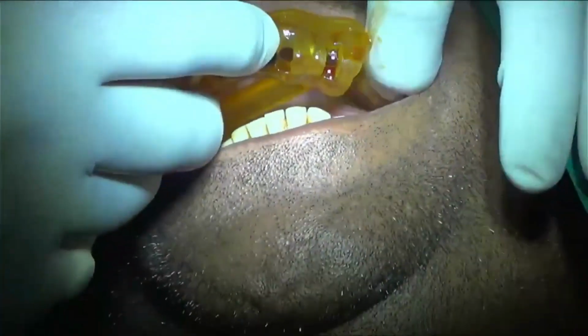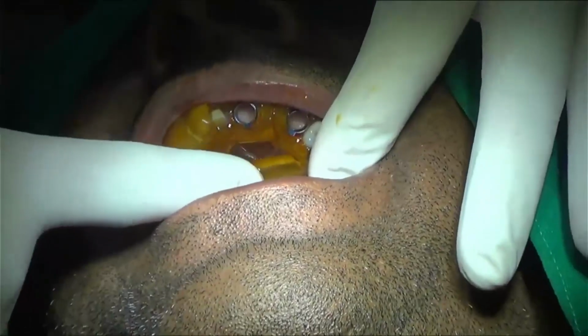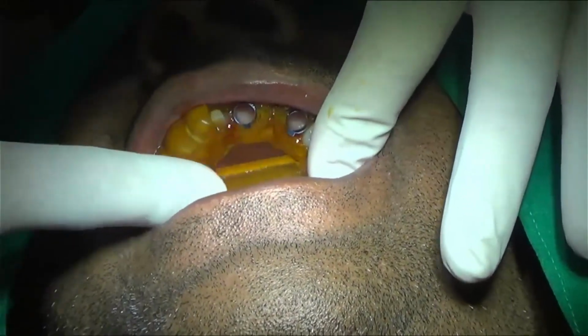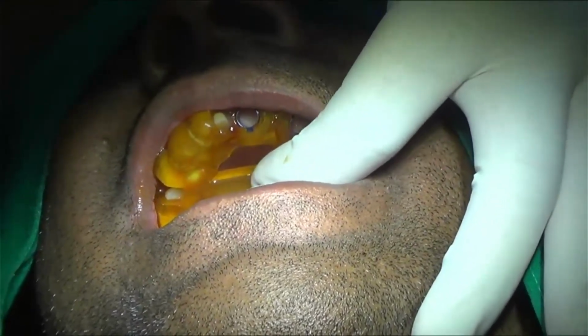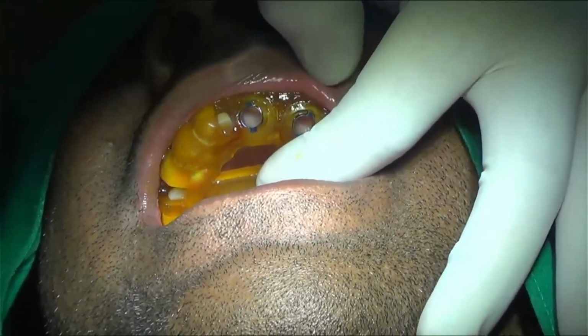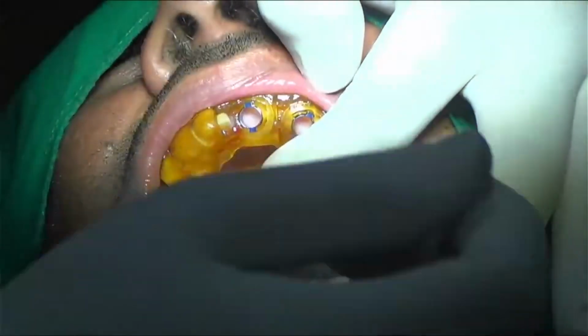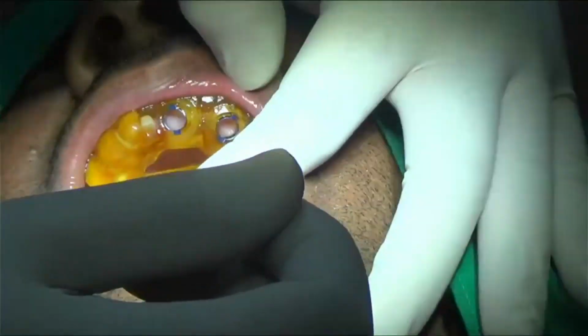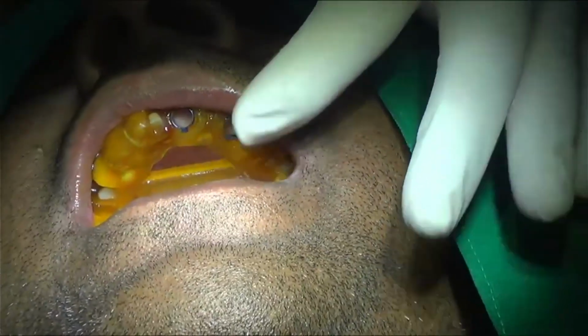The first and foremost thing that we do is put the surgical guide, and you can see this bar. This bar is so that you can put your finger on it to stabilize the surgical guide. One of my fingers is always going to stabilize the surgical guide, and from the right side I am going to do the drilling. So: stabilization, drilling, then leave it, and then irrigation.